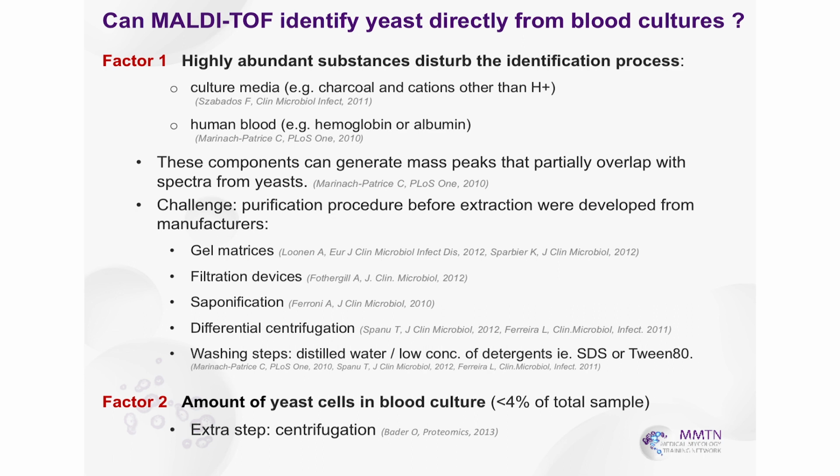These components can generate mass peaks, and these peaks will cause misidentification. So you need not only the machine, but also skilled technologists too. Then the challenging purification might help. So here, they try several methods, several processes, to purify the yeast.